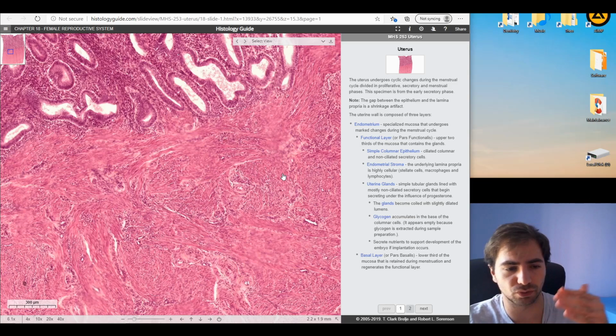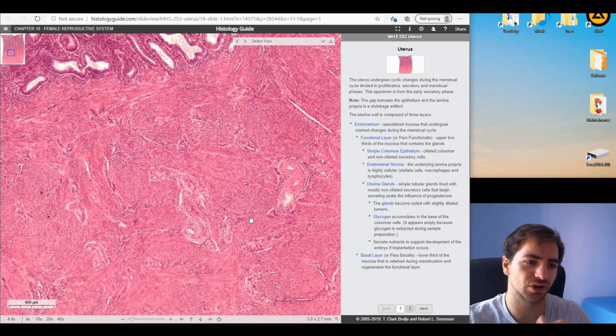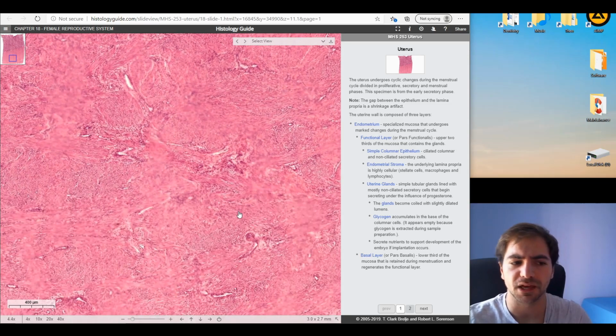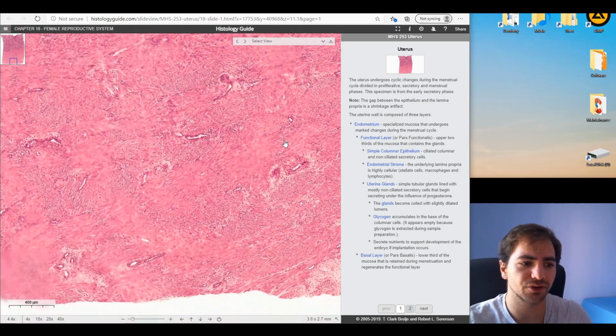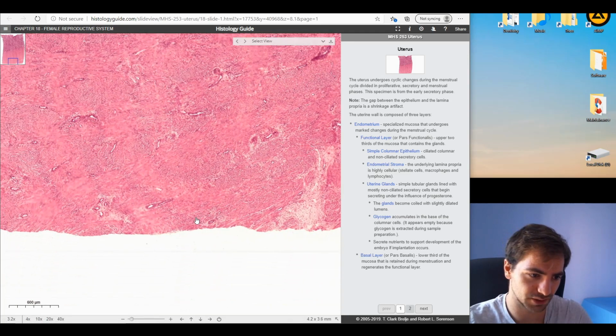This is a more circular, more, let's say, oblique one. But typically speaking, in a very, very well oriented clean section, we should be able to see the distinct layers of all 3. More typically speaking, we should find that the outermost layer has the more typical orientation of the longitudinal section, and this is what you should actually visualize.